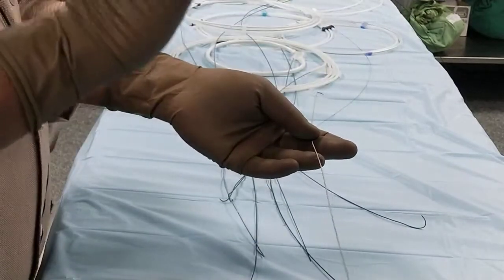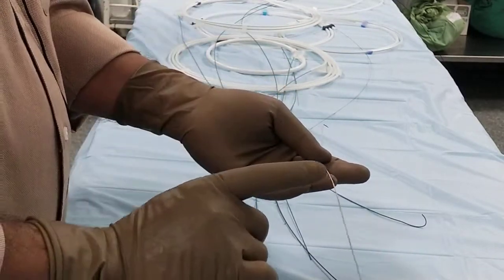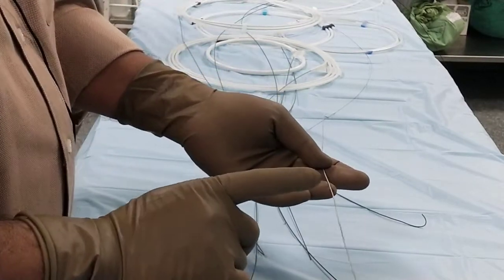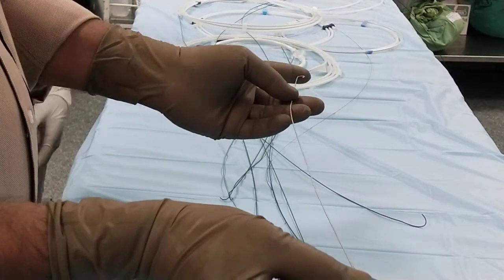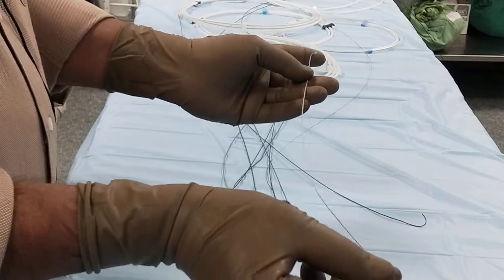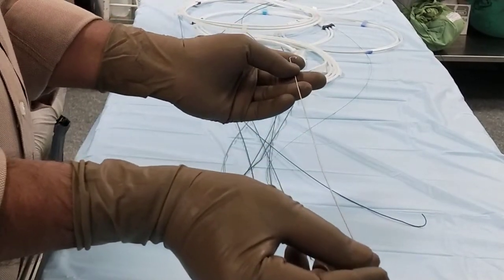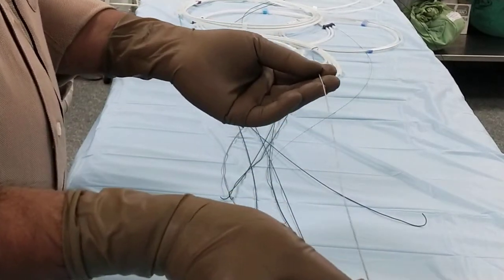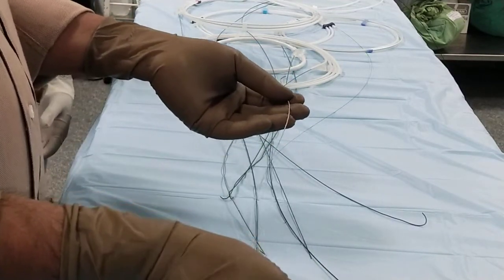The needle is always measured in gauge. The catheter is measured in French. The sheath is measured in French. The length of the catheter, guide wire, and sheath is measured in centimeters. This guide wire is 30 to 40 centimeters long, which is enough to insert a sheath into the system wherever you want to go.